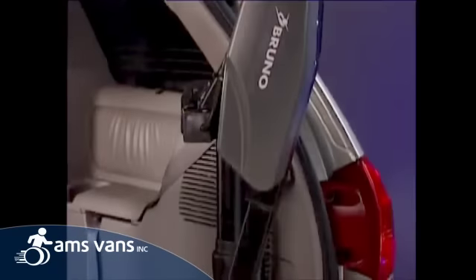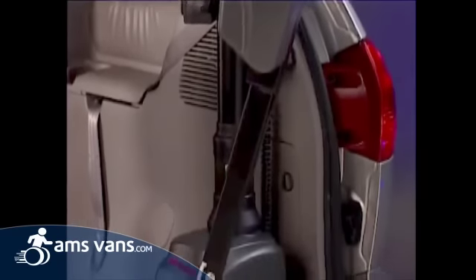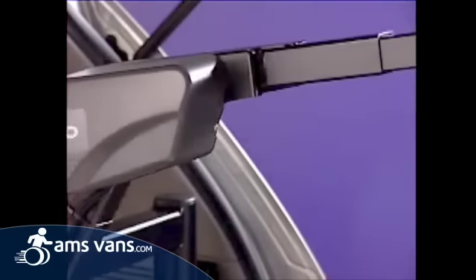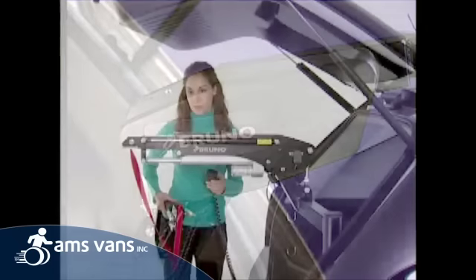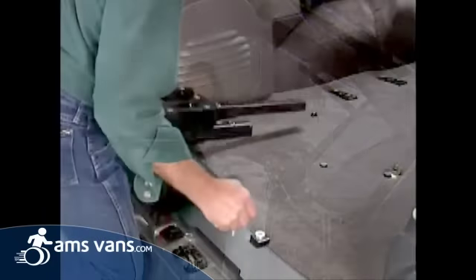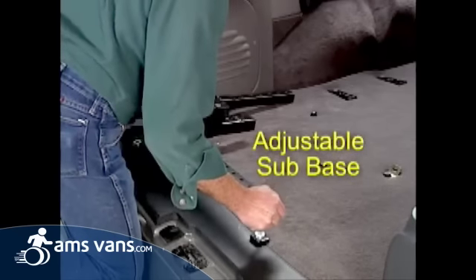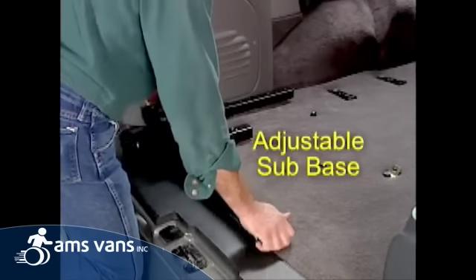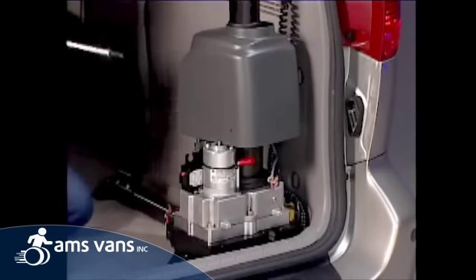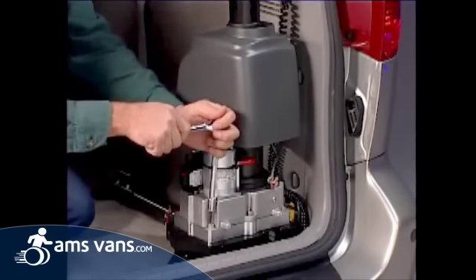Supremely modular, with hundreds of Bruno custom sub bases and a selection of various offset arms, the Curbsider is truly the versatility king. Our adjustable sub base offers even more solutions. Moving to a new vehicle or a new mobility device? Chances are your Curbsider can be quickly and easily retrofitted.